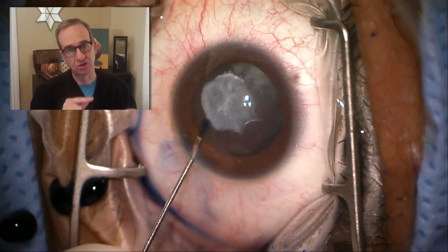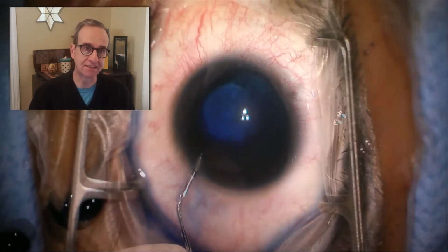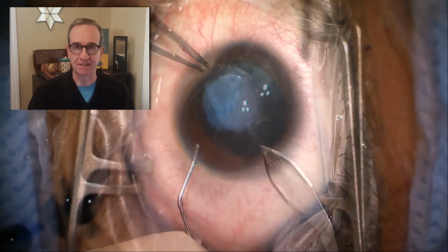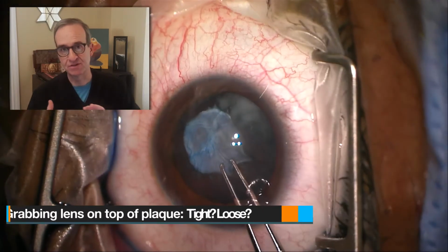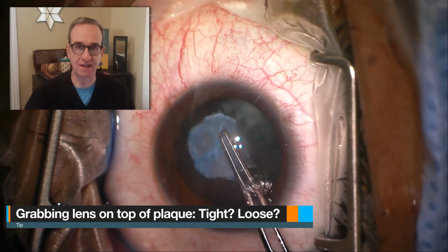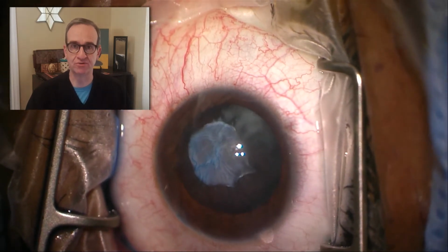So what do we know by this stage? We know that the lens is decentered. We know it has a dense capsular plaque. We know that the capsule has tension lines in it, and it may be difficult to tear. And we don't know whether the lens is secure in the eye or not. So what we're going to do in the next section is we're going to stain the capsule. That'll show us very nicely the tension lines in the capsule. Then we will place the keratotomy and then do some steps to see if the lens is tight or loose. We'll try to determine that before we begin to interact with the capsule to produce the tear within it.